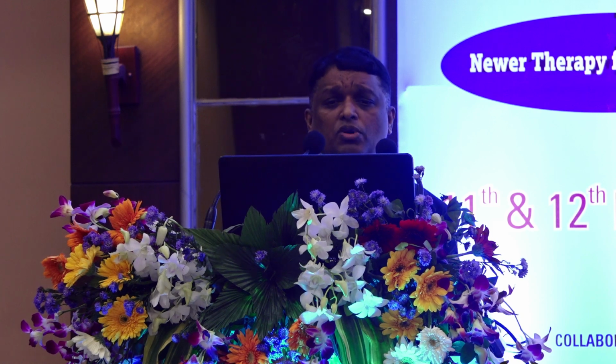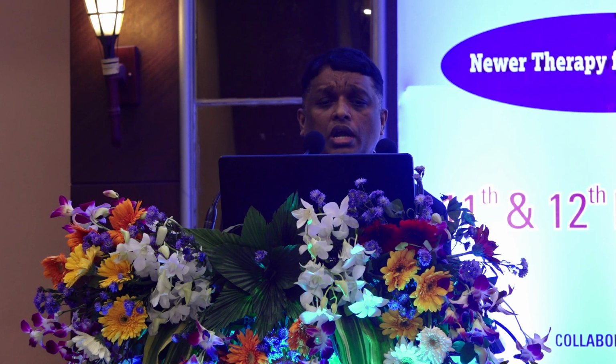What are the contraindications for brachytherapy? Pre-existing rectal fistulas, a patient who is unfit for anesthesia, spinal epidural anesthesia, no proof of malignancy, or absence of a rectum, because we need a rectum to do the TRUS-based implant, that's more important. And there are other relative contraindications: previous radiation to the pelvis for other reasons, prior rectal surgeries, inflammatory bowel disease, and larger volume of prostate more than 60 cc.